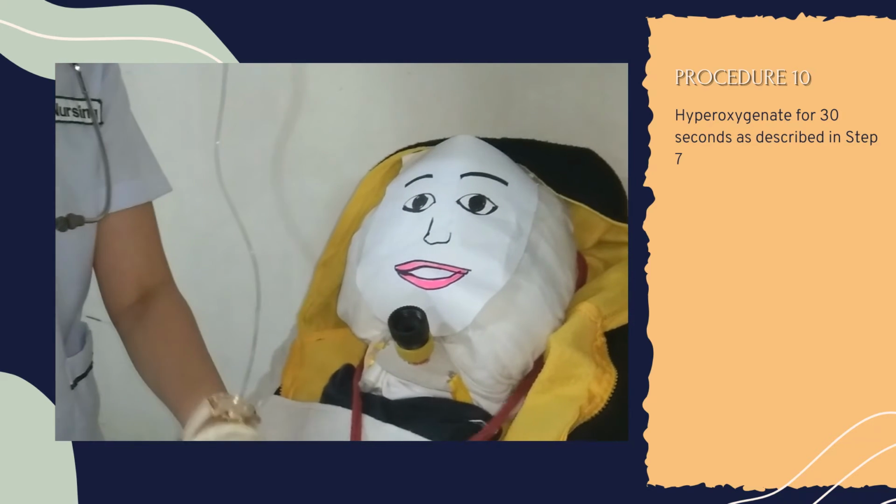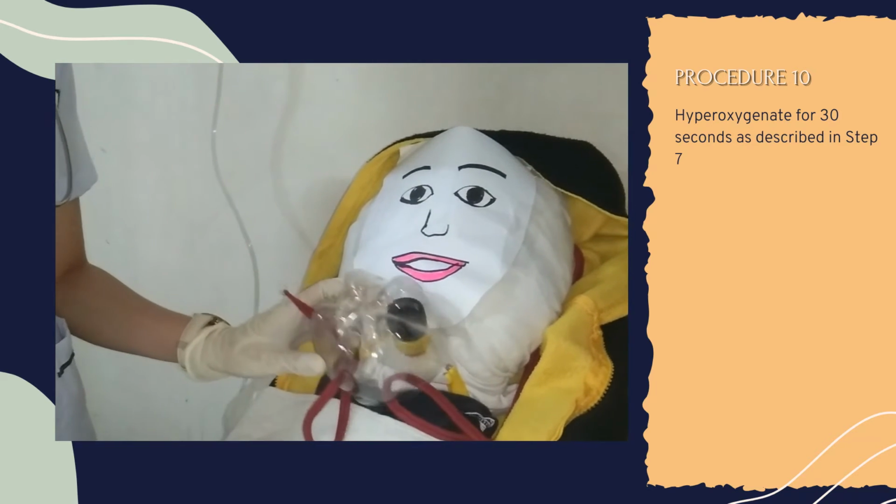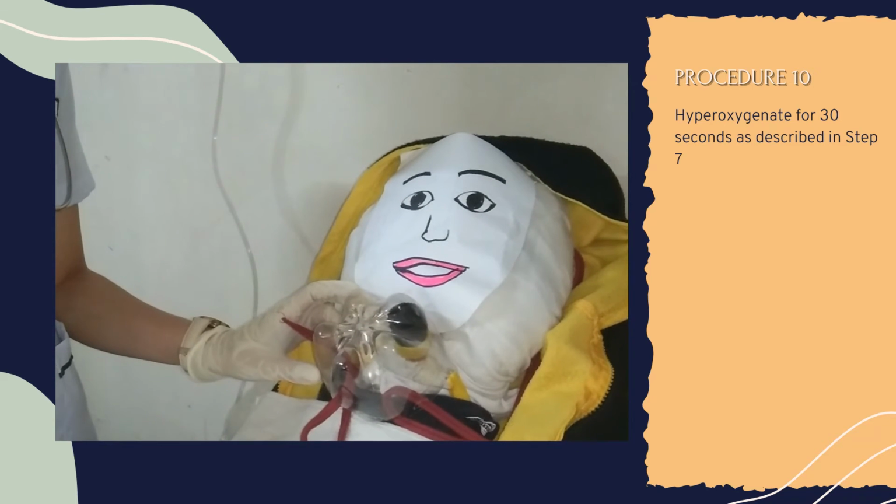Hyperoxygenate for 30 seconds as described in step 7. This prevents decrease in arterial oxygen level during the suctioning procedure.